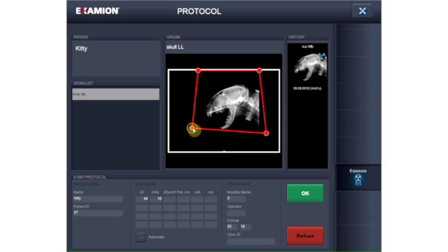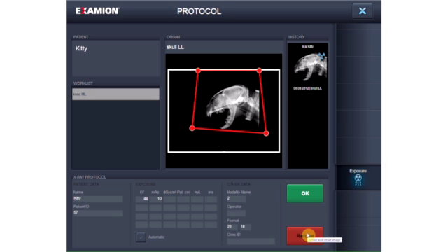The image can be confirmed and saved or deleted. It's possible to alter or add to the x-ray protocol entries, such as in the exposure parameters or operator fields.